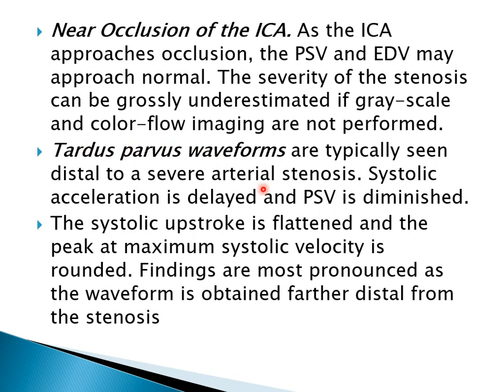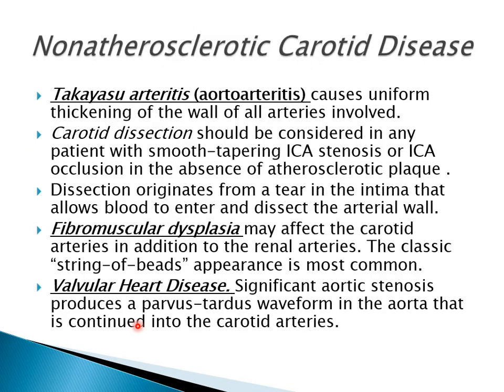Tardus parvus, as we said: if you have significant stenosis after that, you will have this pattern of spectral Doppler. The systolic upstroke is flattened and the peak at the maximum systolic velocity is rounded. Findings are most pronounced as the waveform is obtained more distal from the stenosis.